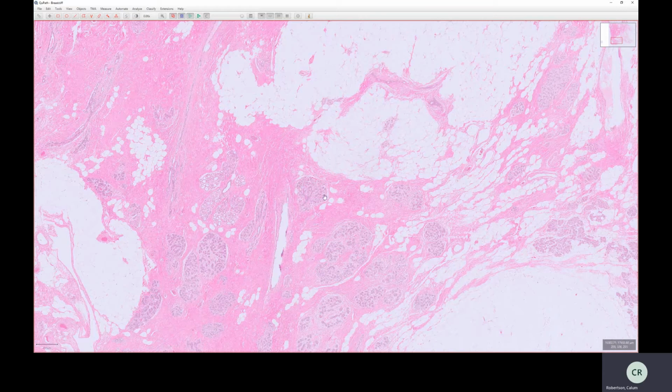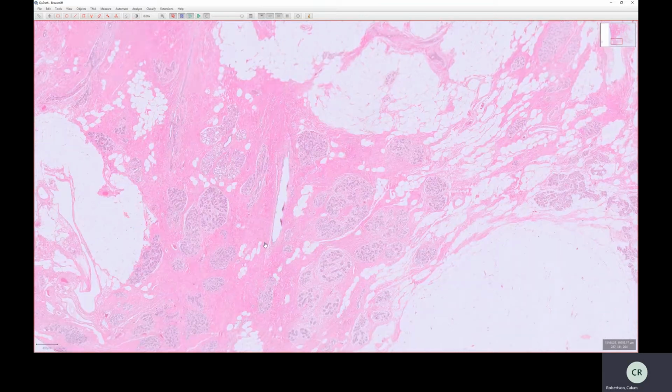That's an acinar arrangement. So all these small glands are discharging their secretion into the small ductule, which is coming this way. We lose it in this section, but it might open into this larger duct. And all of these lobules will have similar ducts, but we can't see them clearly on this plane of section.